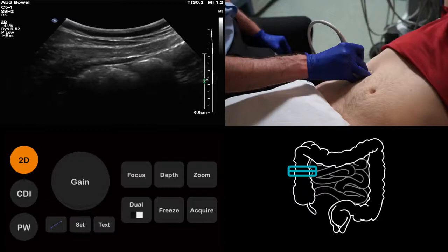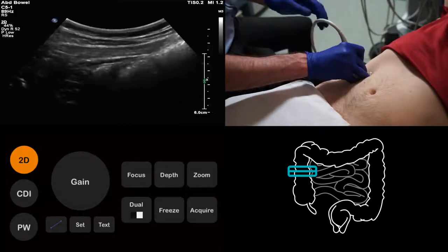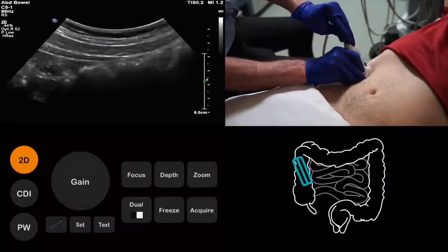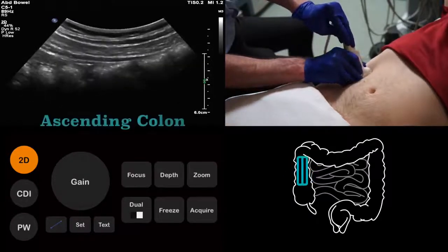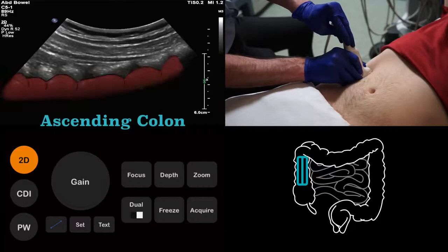But how do we tell the large bowel from the small bowel? The colon will have haustra, which gives it a lobulated contour, while the small bowel has valvulae conniventes, which do not cause undulations in the bowel wall. By turning the probe into the long axis of the colon, we are better able to see the haustra, and therefore confirm that we are looking at the large bowel.